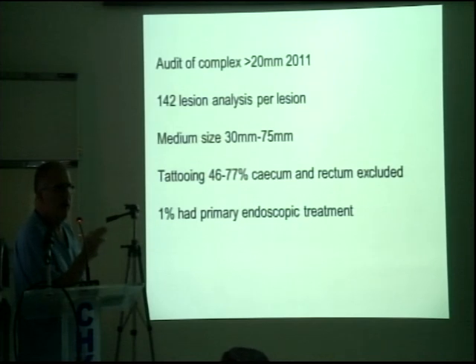Now, the area of most common missed lesions, where do we miss lesions most? I mentioned this on day one. Bends? Okay. Where do we miss lesions most? I mentioned it on day one. Cecum and rectum.